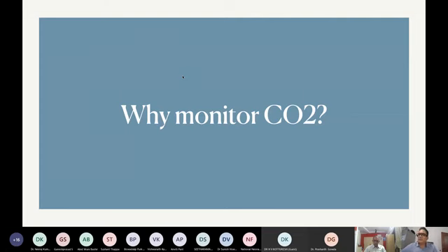And traditionally, in the past, we used to use transcutaneous CO2 with a basic thermal device. But the heat generated by that is very significant, and that may result in tissue burns. But the current transcutaneous monitors are very trendy and sophisticated, and there are no problems with that. I will show you that one.